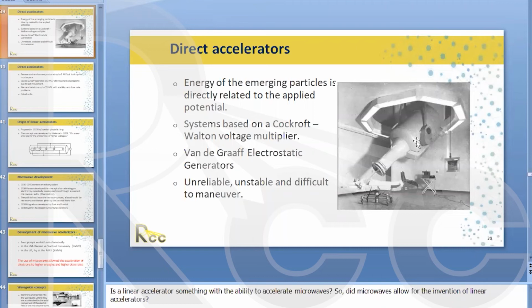So early therapy, not only skin burns and bone necrosis, but you were limited in how much dose you could give because of the side effects. But now with modern therapy, you can focus the beam so much that you can avoid the surrounding tissues and get the beam very, very exact where you want it. Give higher doses, less dose to surrounding tissue, less side effects. So yes, Cobalt was really the beginning of where the doctors were taking advantage of skin sparing.